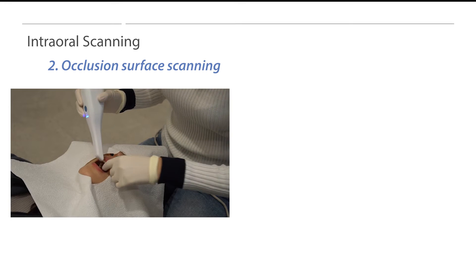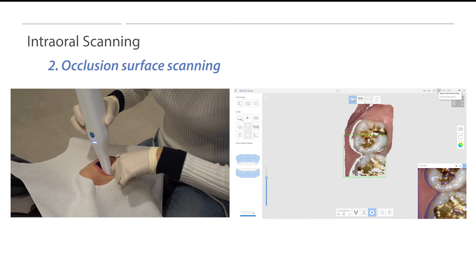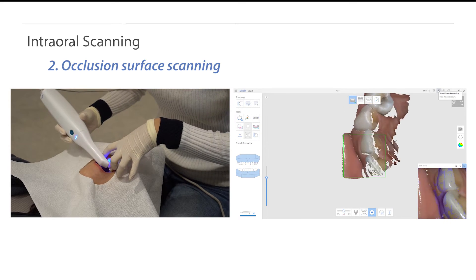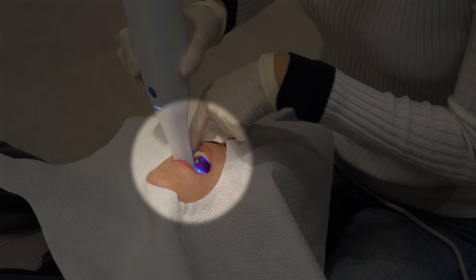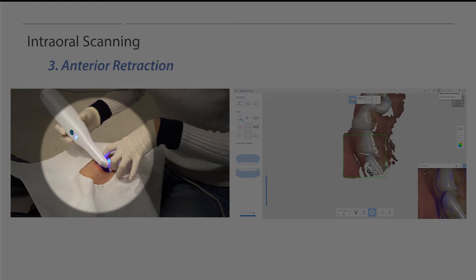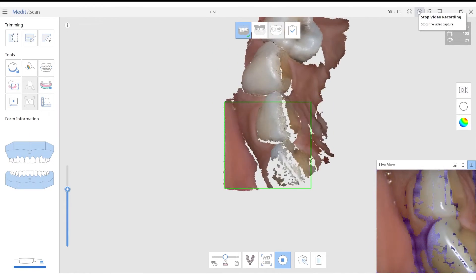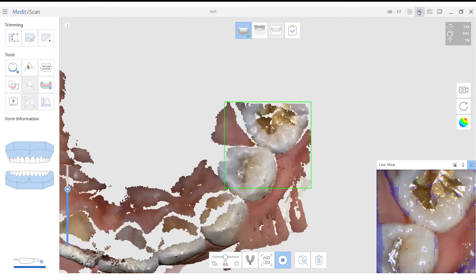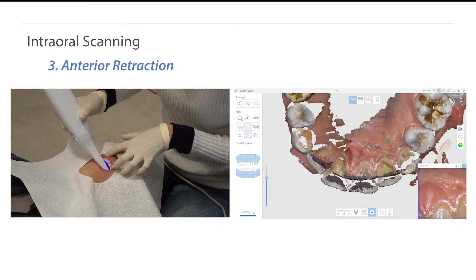Start scanning from the occlusal surface area with distinct geometry and continue to the buccal or lingual surface. Users can minimize soft tissue obstruction by retracting and moving the index finger along with the scanning direction. Scan the anterior teeth in a zigzag manner around the incisal edges. The zigzag technique is used to capture the incisal edge, labial surface, and lingual surface in a fluid motion. Following this scan strategy will help users get the most accurate scan data for anterior units.